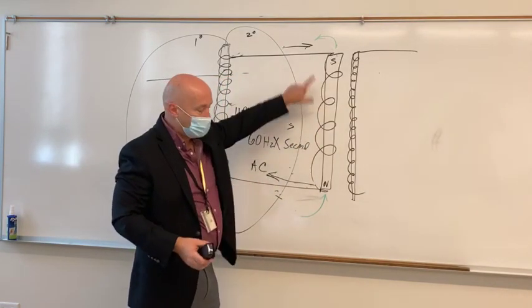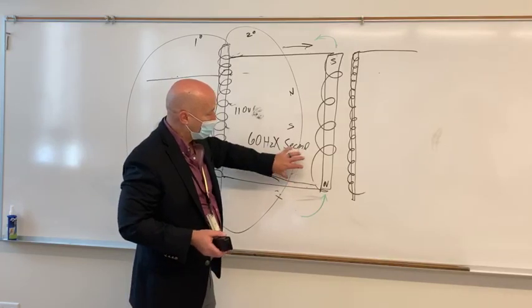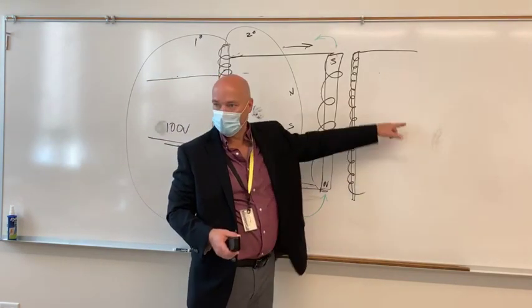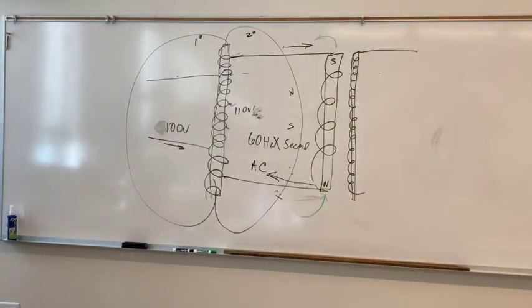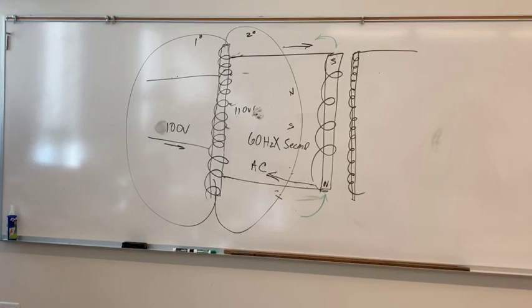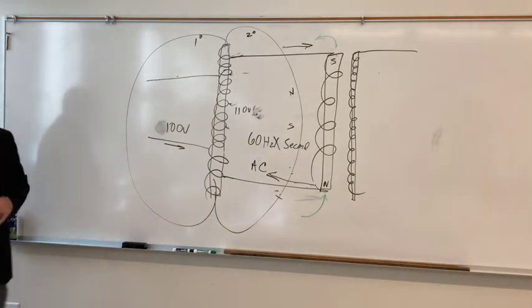So if I can flip these magnetic poles 60 times a second, is that pretty quick? Yes. So can I use alternating current to flip my magnetic field 60 times a second and induce a much greater electromotive force on the secondary side over here? Yes, absolutely. But it has to be changing. That's why we have to have alternating current, because that gives us a fluctuation. Our magnetic field is in constant flux, so that as we move a secondary pole closer to it, I can induce a magnetic field on the secondary side.